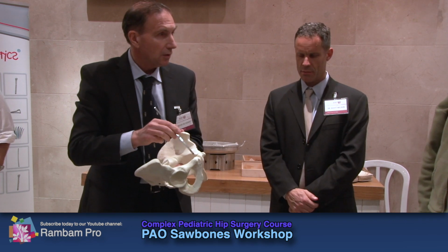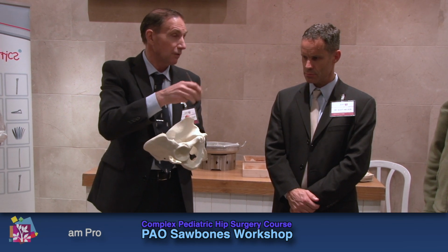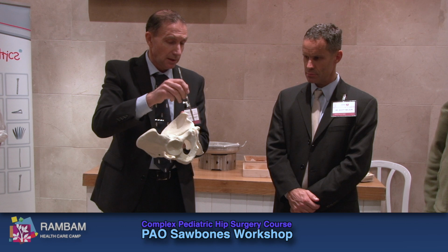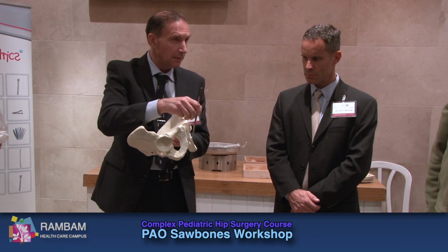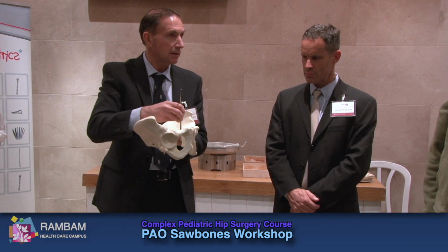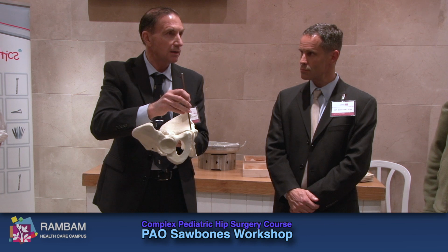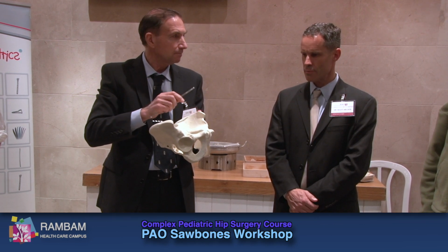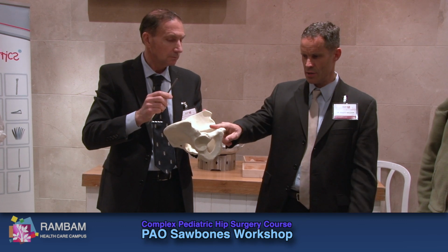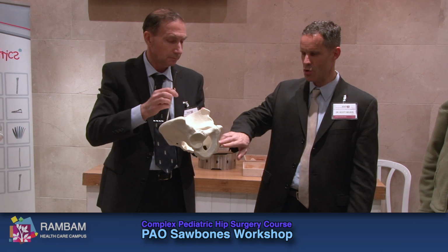Which cuts do I do? So I do my ischial cut first, and pubic cut, and those cuts. Scott's is a very good technique because especially when you're starting out, you do pubic cut, then do ischial cut, leave your osteotome in there, and then complete the cuts here. It all depends a little bit on the approach, because obviously with this osteotome and this retractor in here, it gets quite tight. It depends on what approach you're using. Yeah, I don't have a retractor here with the osteotome.